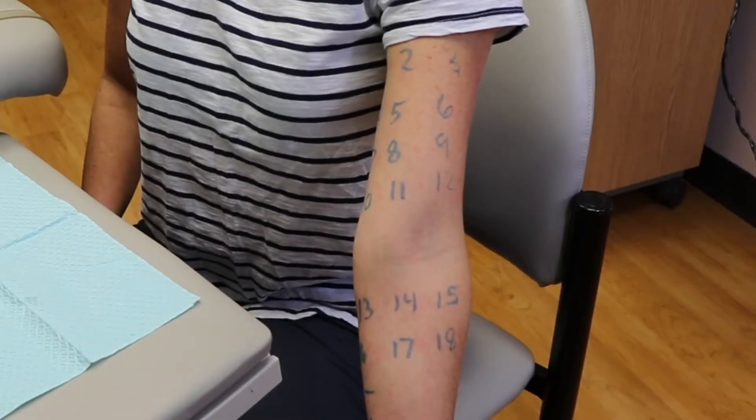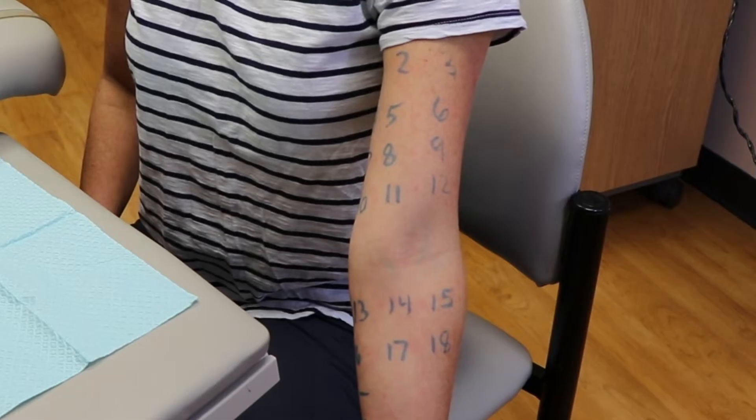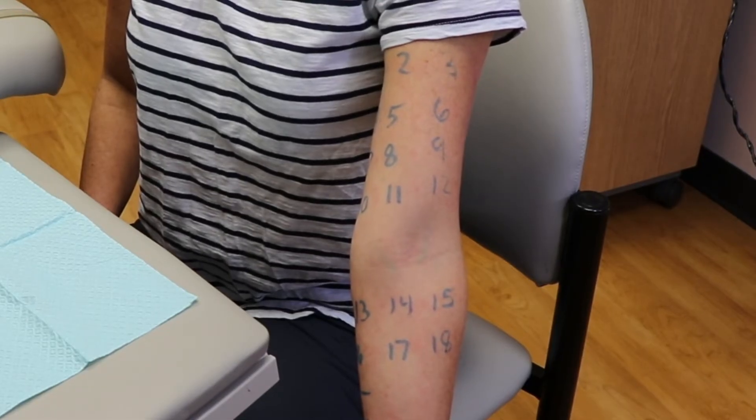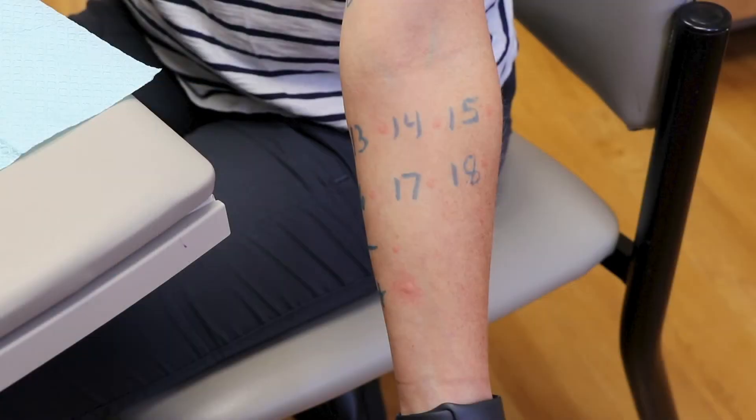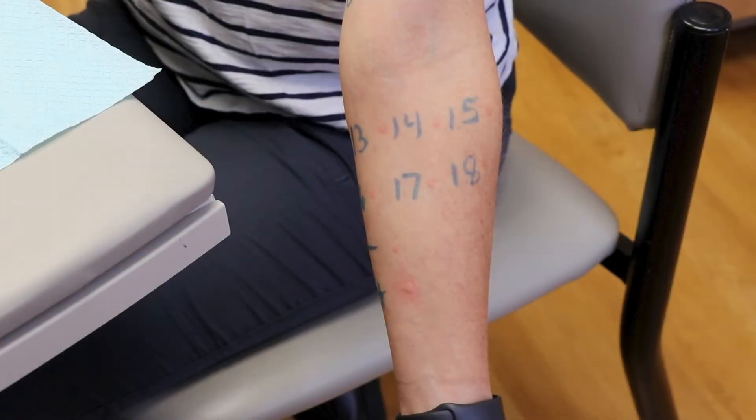These reactions occur within about 15 minutes. In this picture, you will see what your skin will look like immediately after all the pricks are complete. After 15 minutes, your skin will look similar to this picture. There is a positive control that you can see at the bottom of the picture and a negative control above that. This shows us what your skin looks like if an allergen is detected.